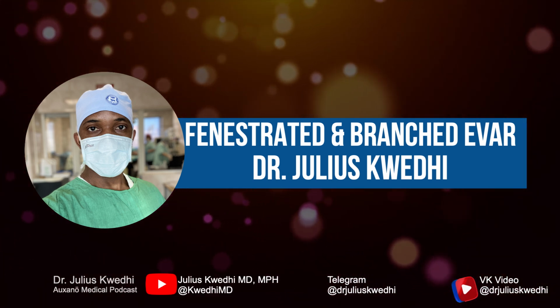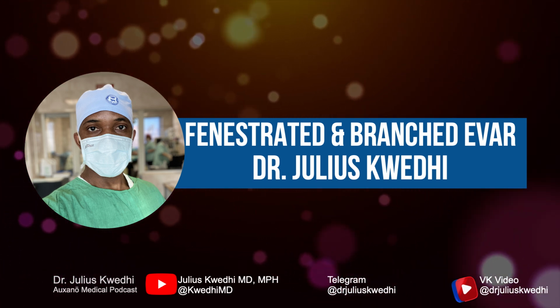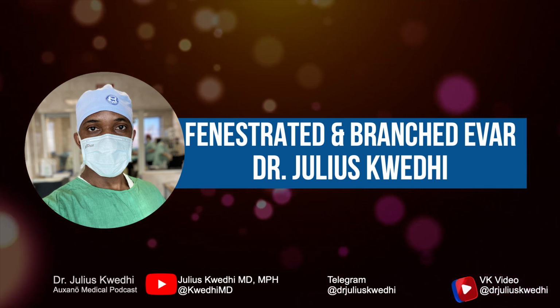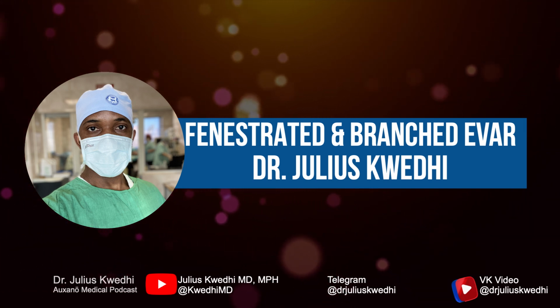What about technical success rates? How reproducible are these results? The contemporary literature demonstrates quite impressive technical success. Multiple series report primary technical success exceeding 95% for both FEVAR and BEVAR.